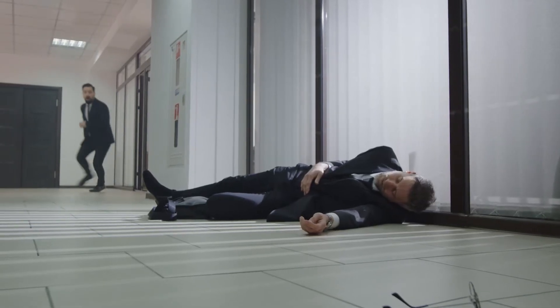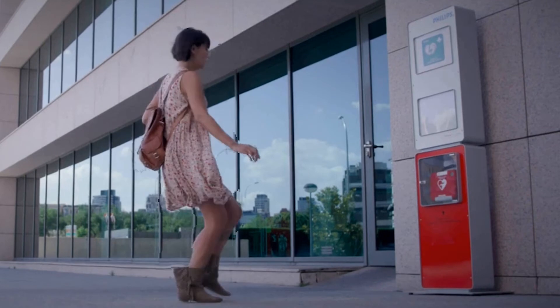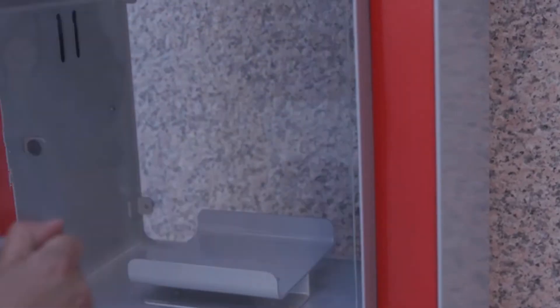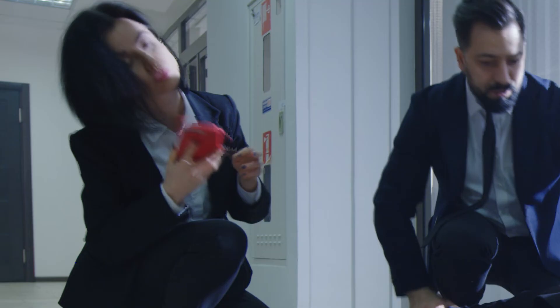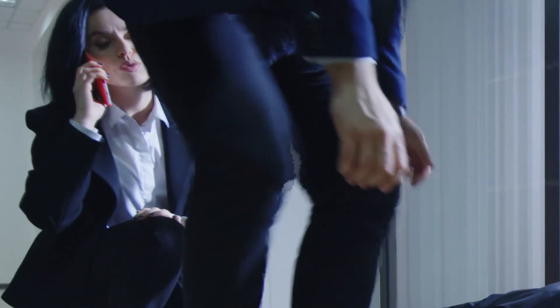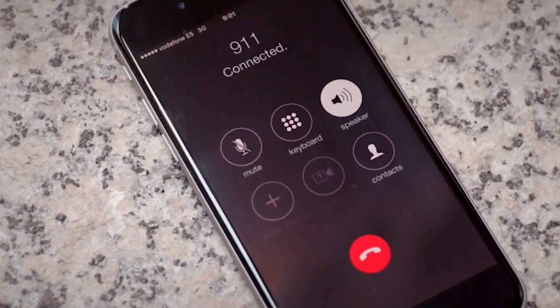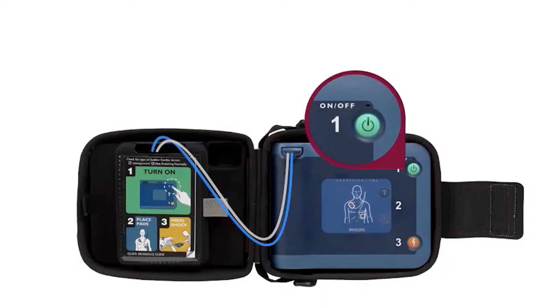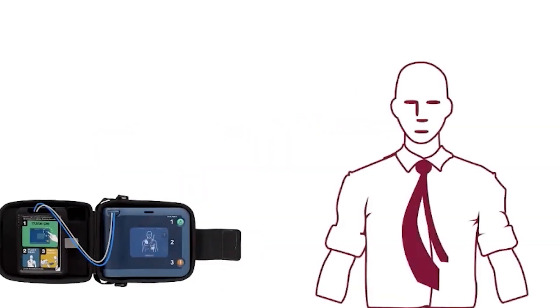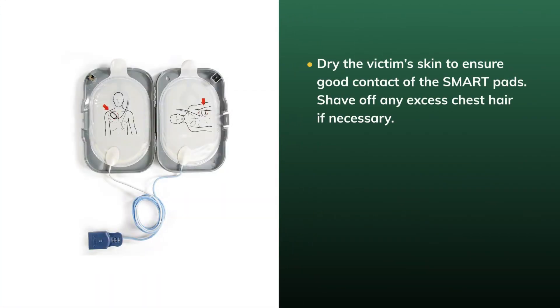During a cardiac emergency, it is important to act quickly but calmly. The HeartStart FRX AED should be located in a high-traffic area for ease of access and routine checking. Someone suffering from sudden cardiac arrest will not be breathing normally and will not respond when touched or shaken. If there is more than one responder available, have that person contact emergency services while you set up the HeartStart FRX AED. If nobody else is available, contact emergency services first, then get the HeartStart FRX AED. Press the green On-Off button to turn on the unit. The device will direct you to remove all clothing from the victim's upper body, then remove the SmartPads case from the carrying case.